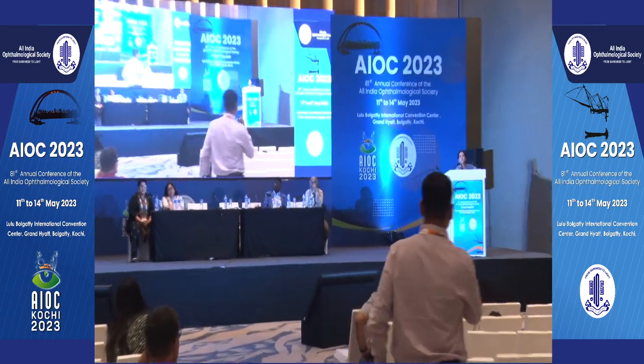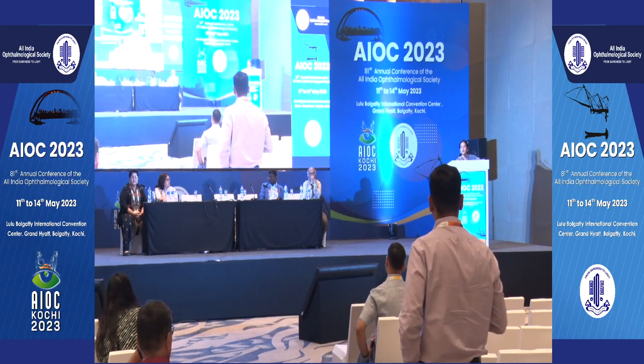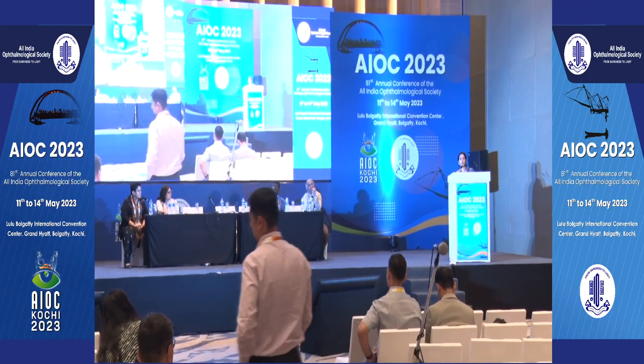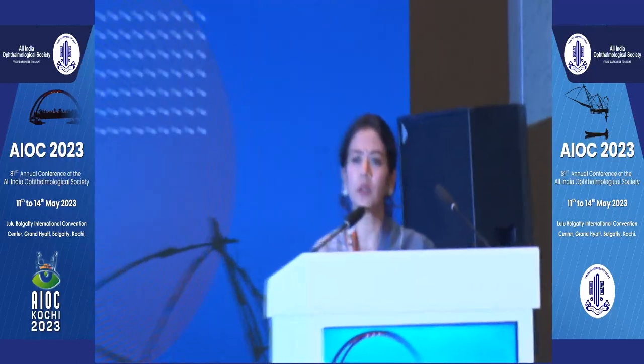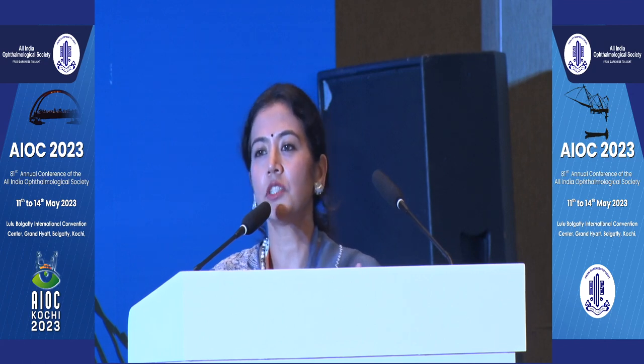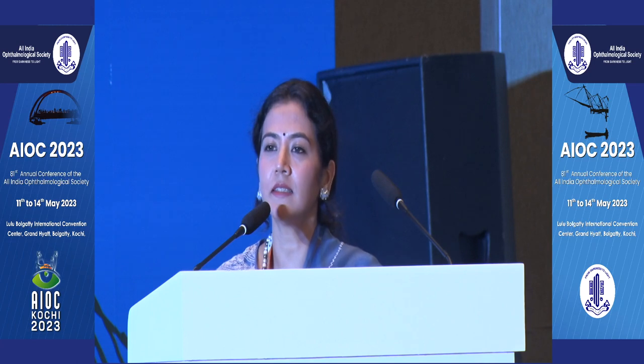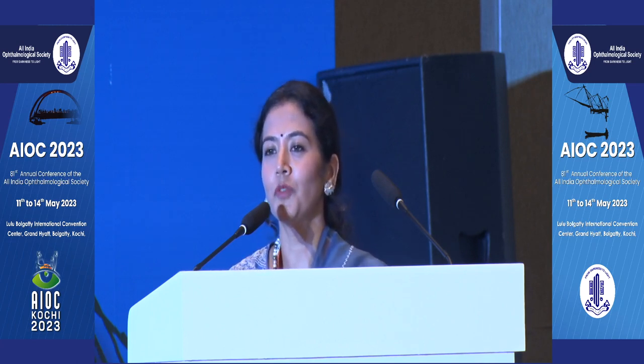Any incidence of cataract post-surgery, and what is the longest follow-up you have? In these three children, no. But sometimes, if you are not able to separate it from the posterior capsule of the lens, then your lens calculation is always done so that you are prepared for it intraoperatively itself. If at all there is a lens touch, then you convert it. So the option is kept, but you hope for it to not happen.